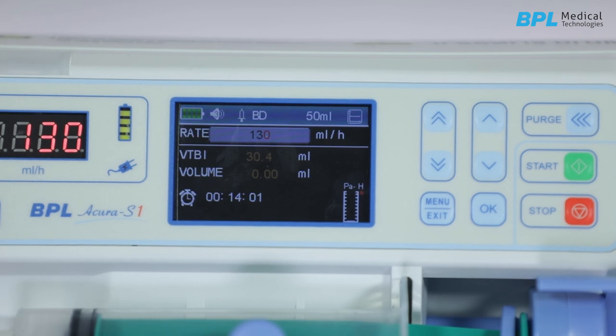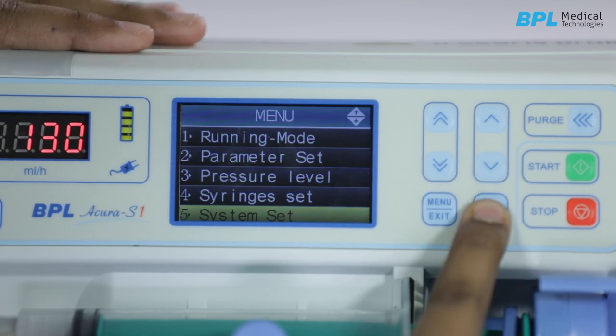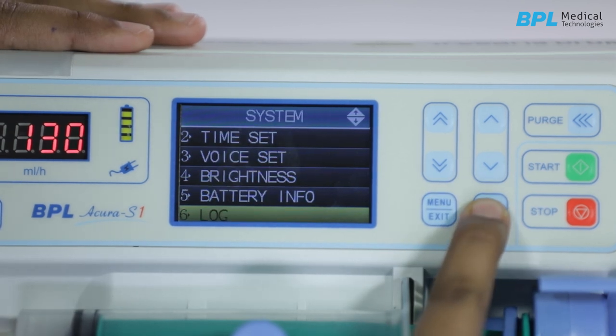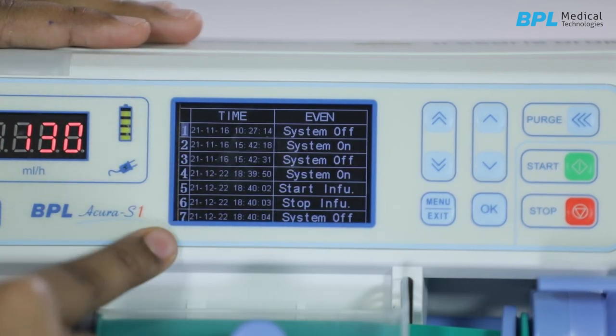The pump saves up to 2000 events. To check these log details, enter the menu interface and select system set. Press OK to enter the log. You can use these keys to view the history of events.